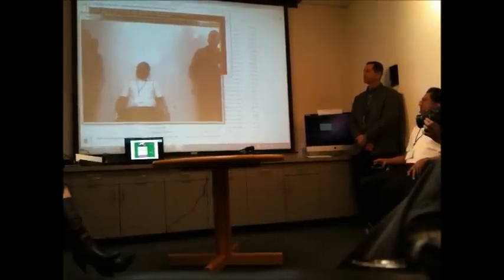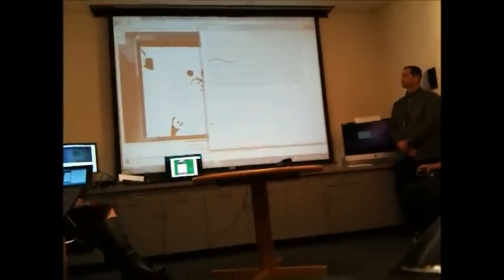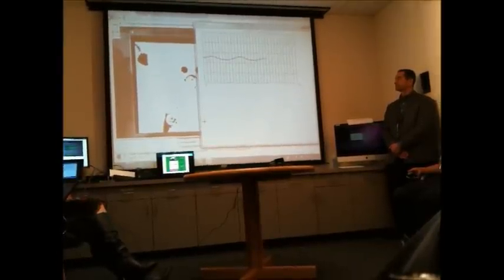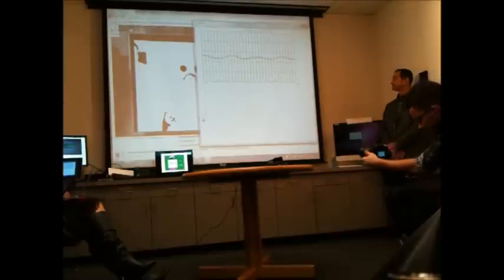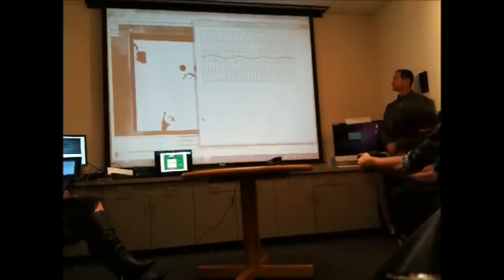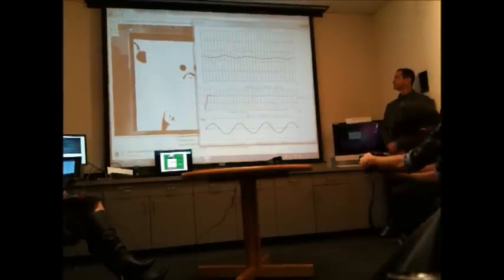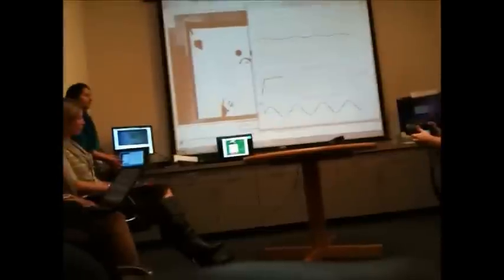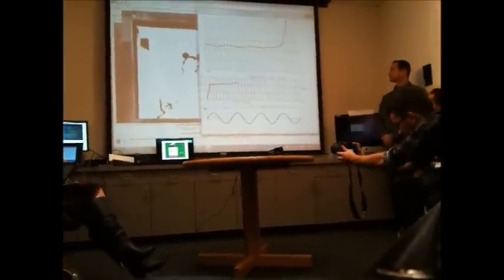Using this, we also calculate respiration rate. The first block on screen shows the volumetric information from inhaling and exhaling, and the second block shows the respiration rate. You can ask the subject to take deep breaths and the signal changes accordingly.